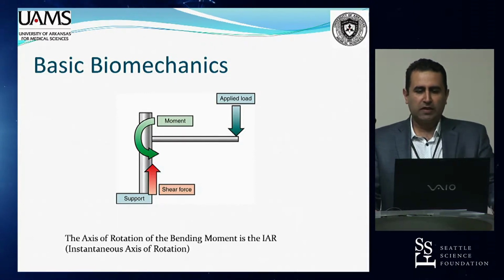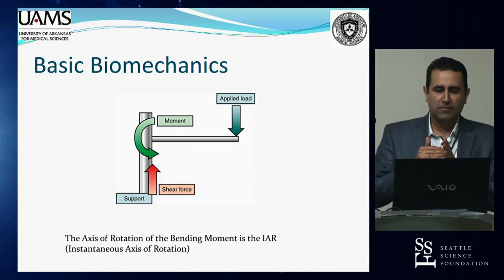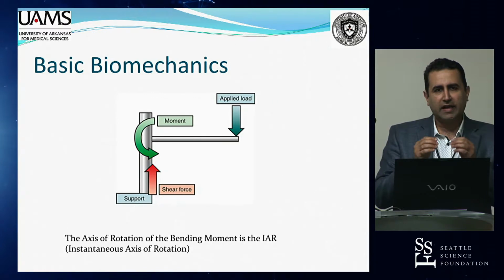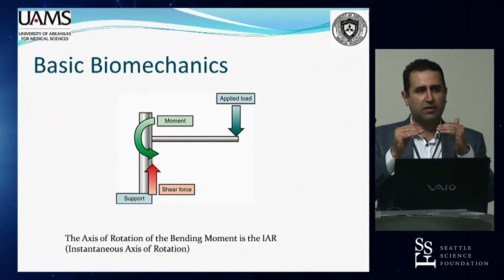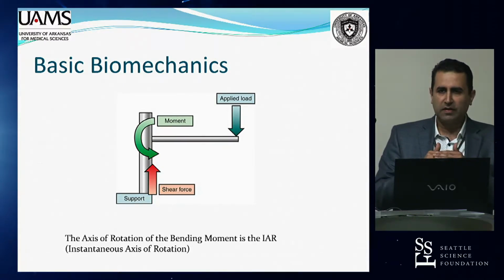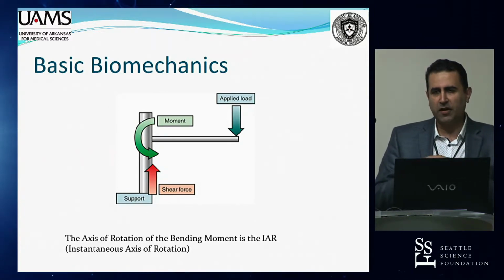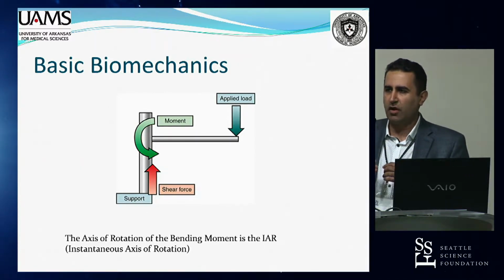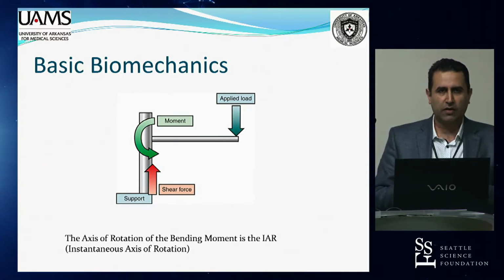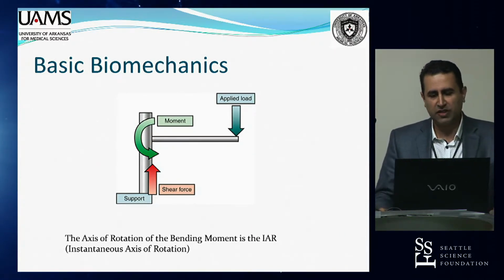So the concept of the screw rod system is much like that of a cantilever, where there is a longitudinal member, and that's the rod, and it connects anchors within these segments, which are typically the pedicle screws that we have. And this cantilever system can be of three different varieties, and we can go into the details, but very basically it can either be fixed, non-fixed, or have an applied moment force to it. In other words, it can take force in different vectors to achieve its goals.